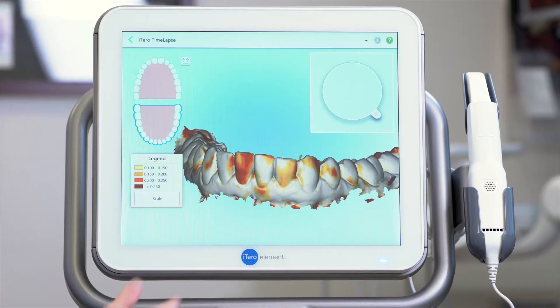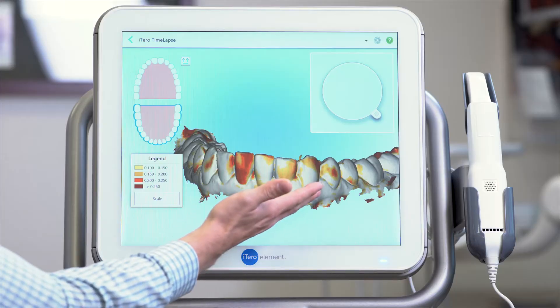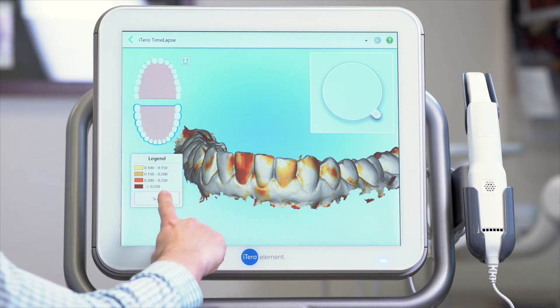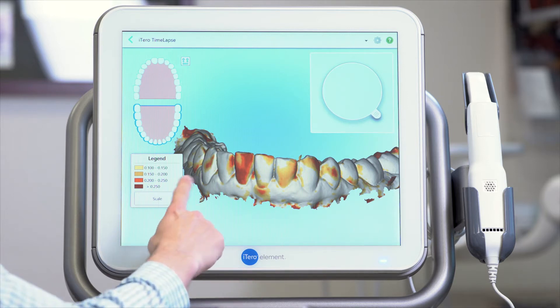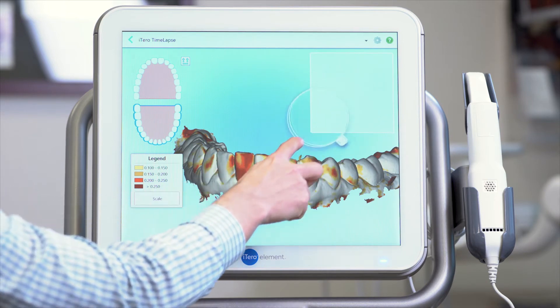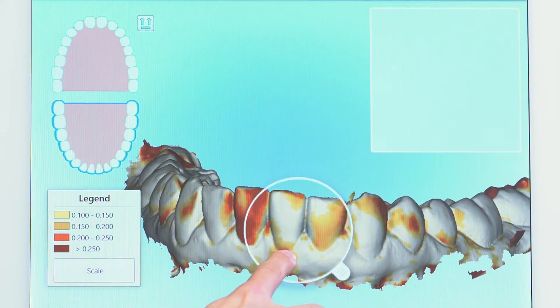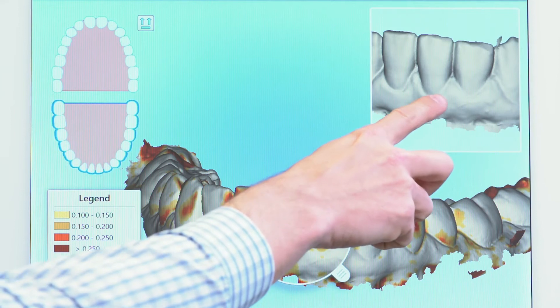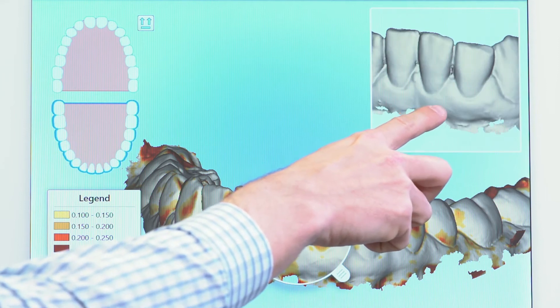Let's take a look at gingival recession. This is a current scan of a patient who had gingival concerns. With time-lapse, I can compare this scan with the scan from her last visit. I see this color map that shows me where the issue is, so I drag the magnifier like this, and I get this time-lapse visualization. It clearly shows me and the patient the changes in her gingiva.